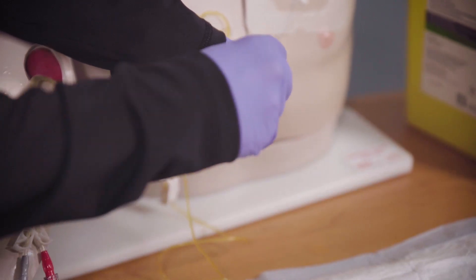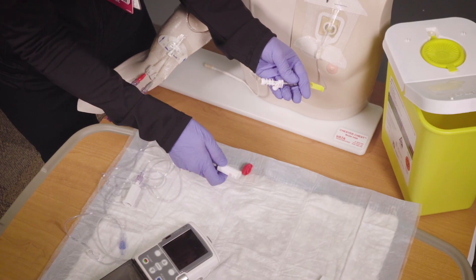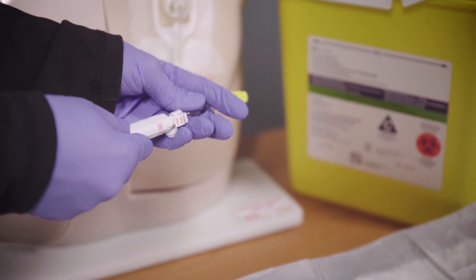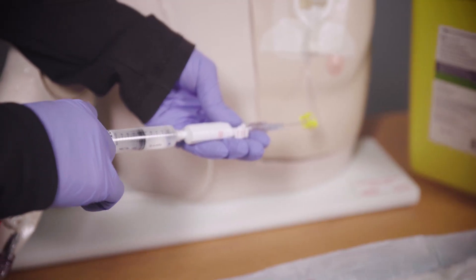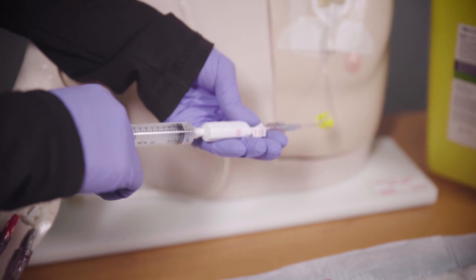Now attach the saline syringe with the female adapter to the male adapter by matching up the red lines and pushing the two ends together — you should hear a click. Open the clamp on your central line tubing and flush the tubing using the push-pause method. Try to leave a small amount of fluid in the saline syringe.